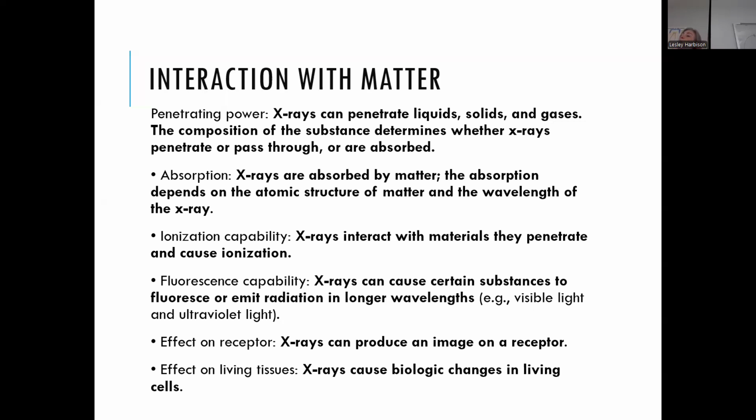Absorption. X-rays are absorbed by matter. The absorption depends on the atomic structure, so that's where the atomic number comes in. But again, like I said in the very beginning, I don't focus too much on that, but it does influence it, along with the matter and the wavelength of the X-ray. That's why the little glass tube is leaded glass.